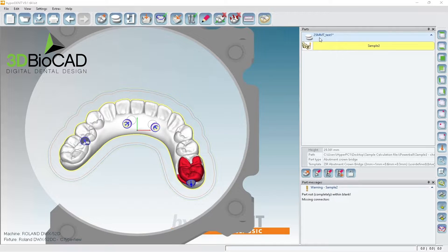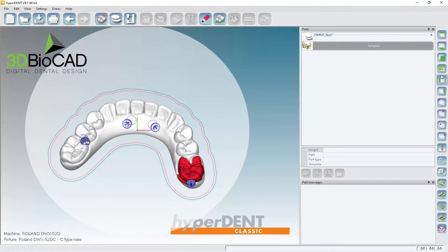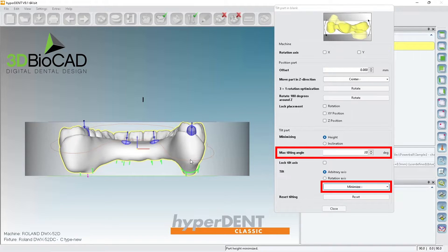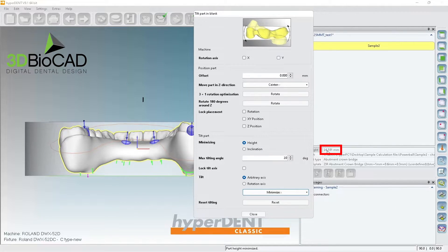Select the fixture and hide it, then go to 'From View.' Just like how we normally do — go ahead and tilt it. This is pretty severe, so I'll do about 20 degrees. Let's see if it fits within the blank — perfect, it's at 24.5mm, so it fits within 25mm.